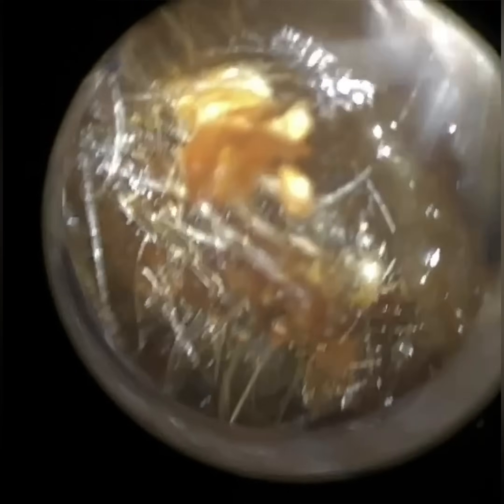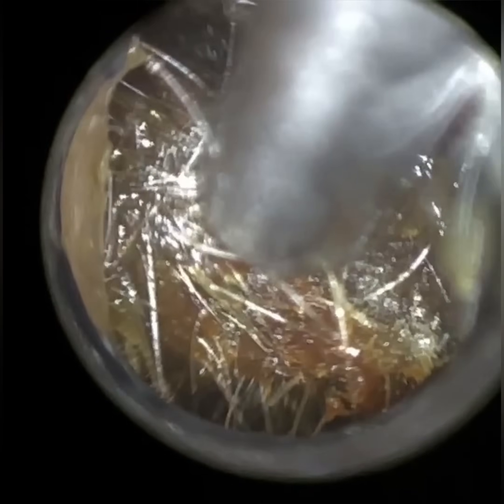I've managed to bring it slightly forwards. This wax plug — you can see it's almost like a bird's nest; there's a lot of hair in there. I've brought it just to the second bend. On the left-hand side you'll see a bit of cartilage — that's the second bend, probably a centimetre from the entrance. It's not going to come further than that, so I'm going to use a hook. This is one of the advantages of the Waxscope: you're not just limited to microsuction — you can use all instruments.